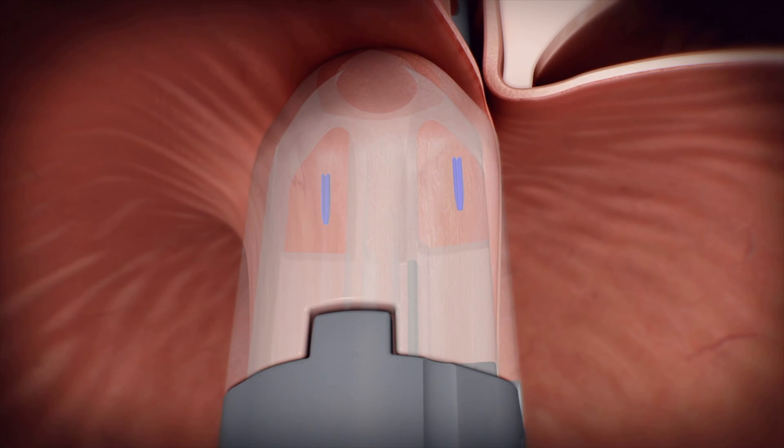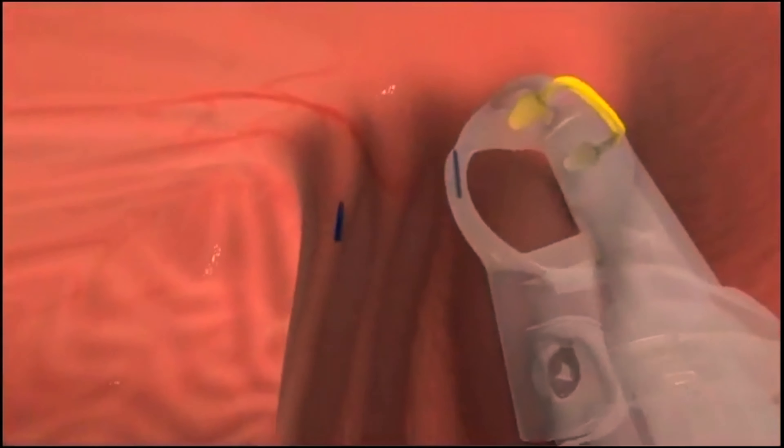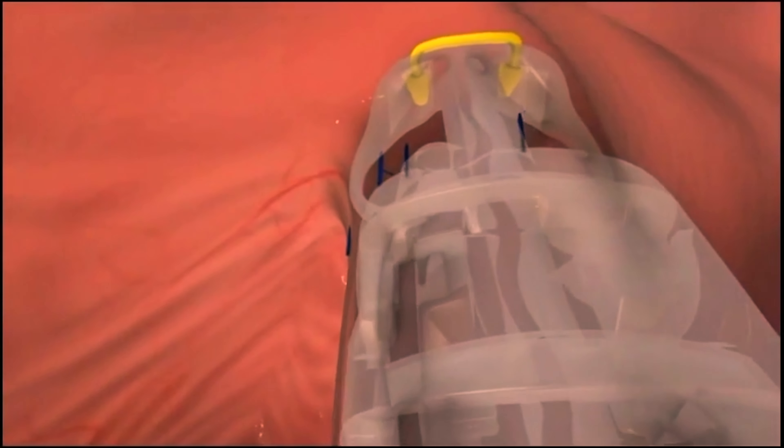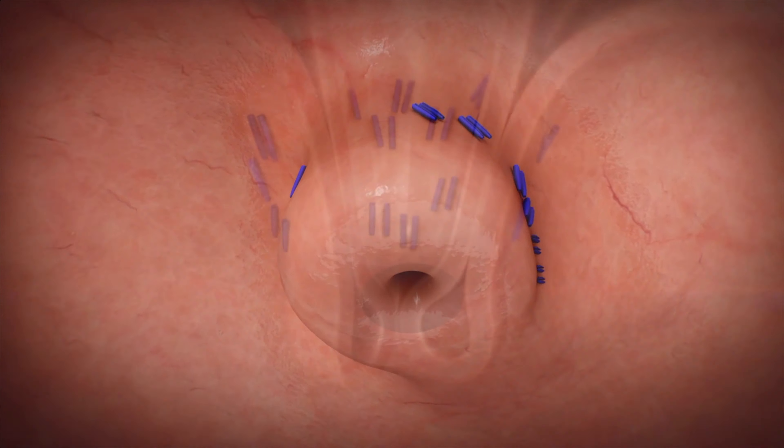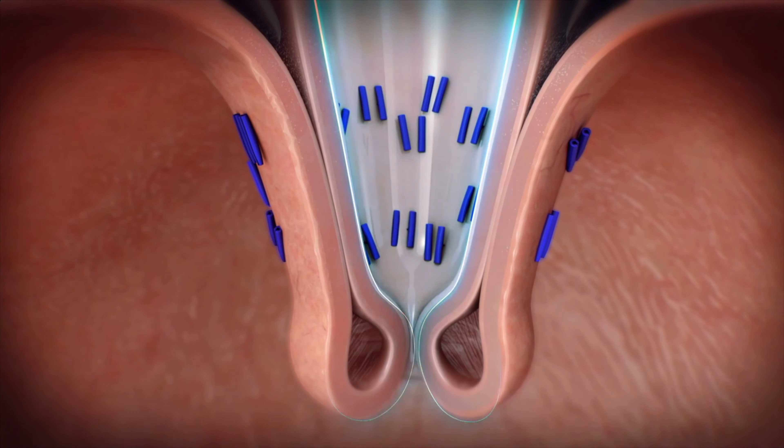Once the stomach wall is positioned correctly, the device can be activated like a stapler, resulting in fasteners being deployed to hold the stomach wall in place and secure the fold. The stapling is then repeated in multiple specific locations to recreate a natural functional sphincter.